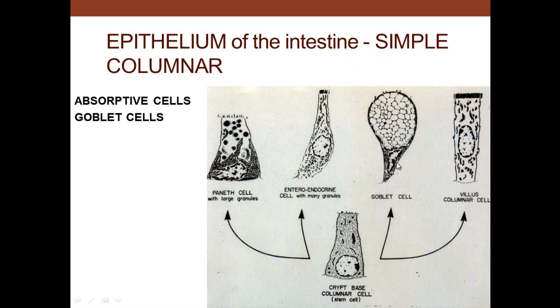It has a kind of thin, small nucleus at the bottom, and then a big flocculent material here, which is a theca, as we'll learn later on, but that's a secretion portion of the cell. And then there's argentaffin cells, which even though it touches the lumen, it discharges contents in the bottom, like any endocrine cell produces it in the connective tissue below and ultimately in the bloodstream.